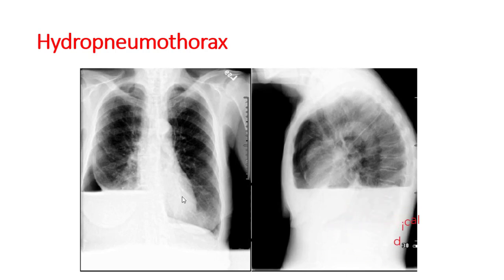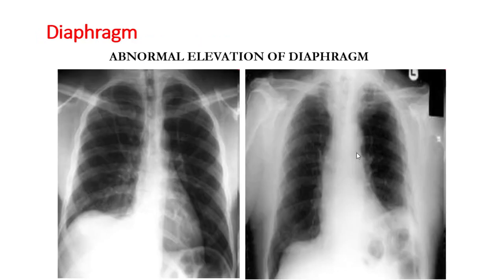Diaphragmatic eventration refers to abnormal elevation of the diaphragm, which may be due to lung collapse or hepatomegaly.